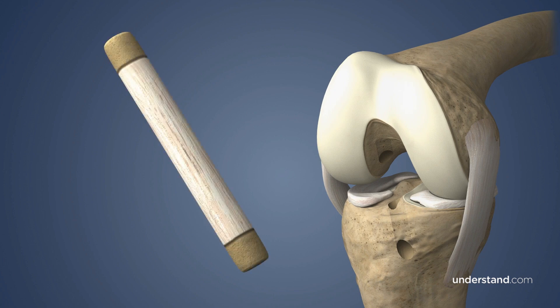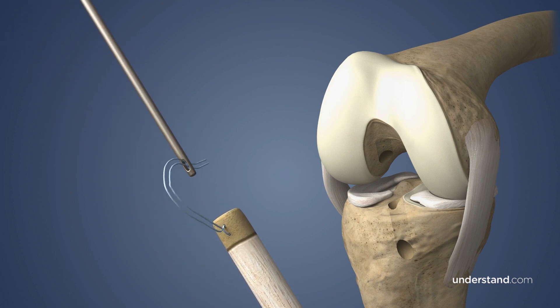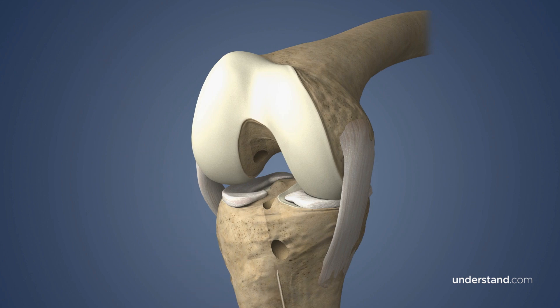After the graft is harvested, holes are drilled into the bone plugs and suture material is attached. The sutures are then threaded through the guide wire and passed through the tunnels, pulling the graft into place. Each end of the graft is held under tension while the bone plugs are secured in place using special screws or other fixations.